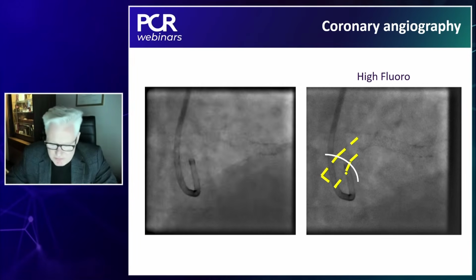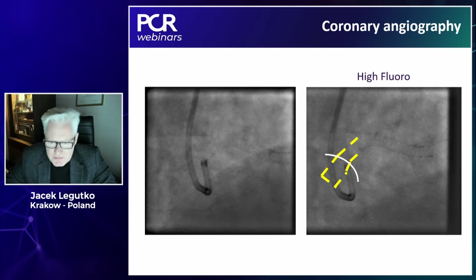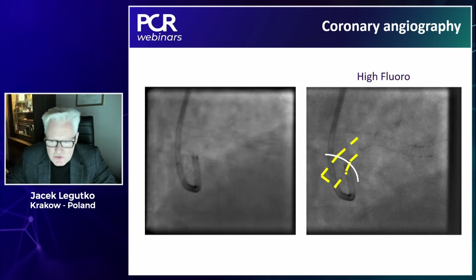So, Jacek, what did you do? Let's go with the case. Before I start, maybe one short rebuttal to Thierry. I absolutely agree with his statement that the positioning of the stent in the ostium is crucial.